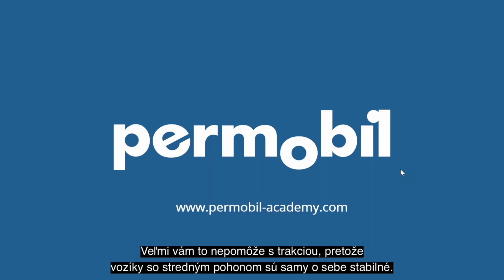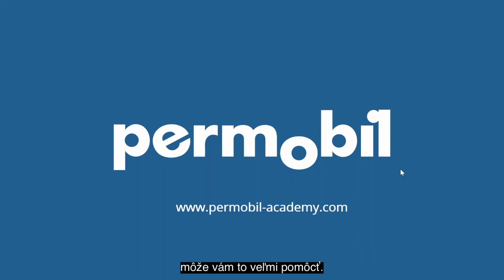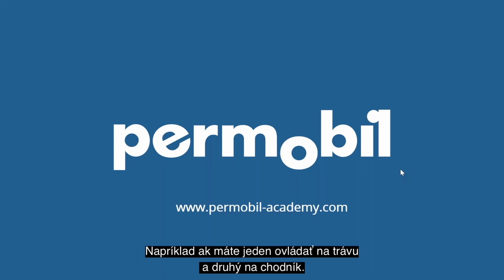It won't really help you with the tracking, because at high speeds, the mid-wheel driven platform is already a very stable platform. But if you change your drive control, for example to a drive control with buttons, then it can be really helpful. An ESP module is not only there to help you with the tracking at high speeds, it also helps with the tracking at low speeds if you have the drive wheels on different surfaces. For example, if you have one drive wheel on grass and one on the pavement.